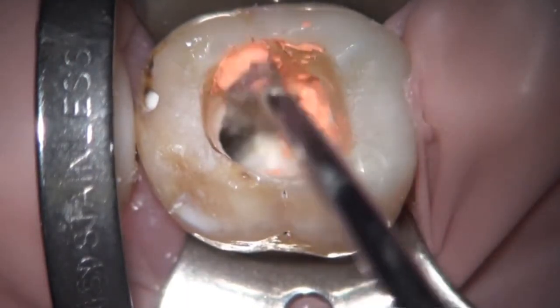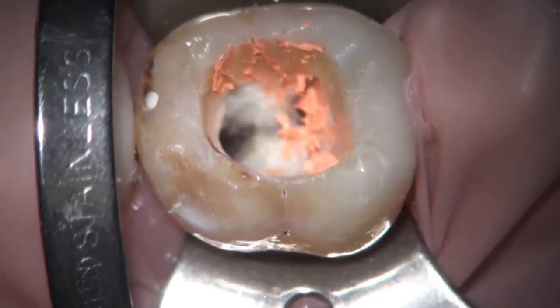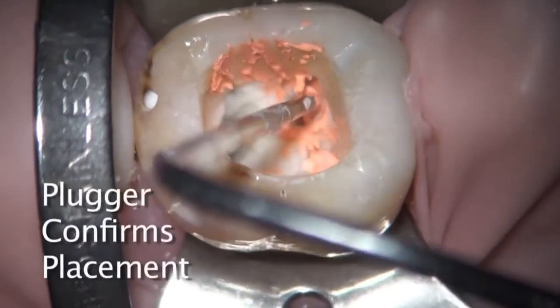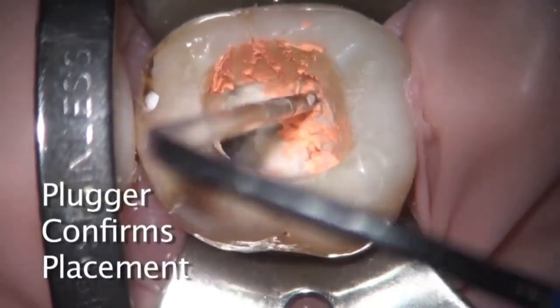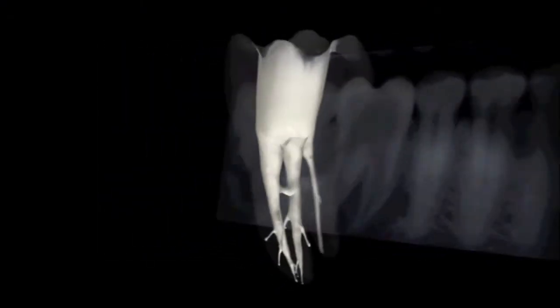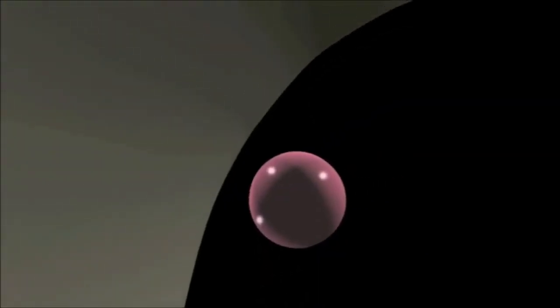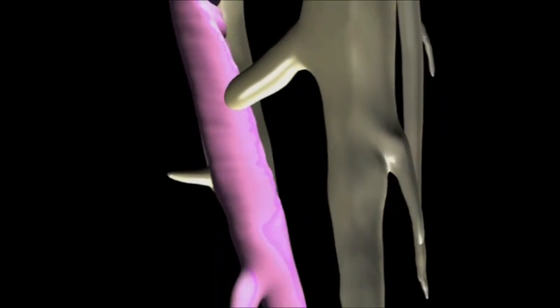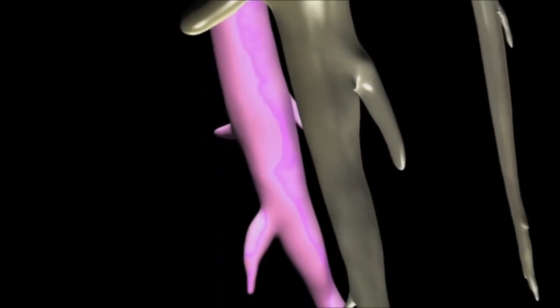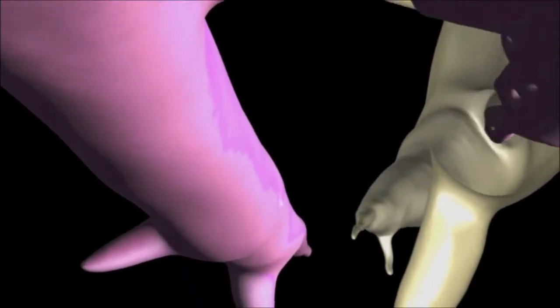Removing a little bit of the extra gutta-percha — now in the distal canal, which is quite broad faciolingually, there's going to be a little condensation and down-packing as the carrier goes in. Place Gutta-Core into the root canal system in one smooth motion without excessive force. The cross-linked gutta-percha core centrally compacts the alpha-phase gutta-percha with a hydraulic force that sends it flowing in three dimensions into laterals, isthmuses, and accessory canals.